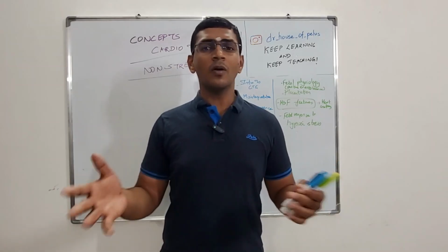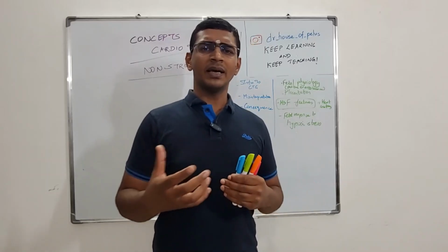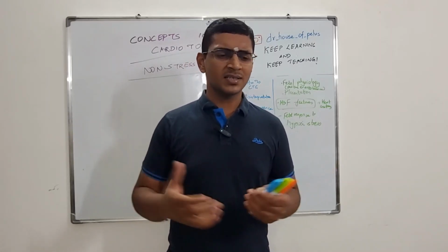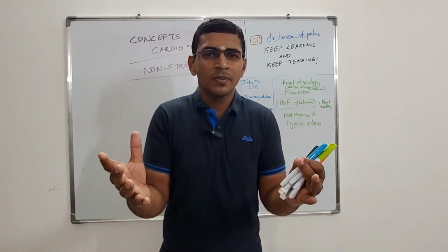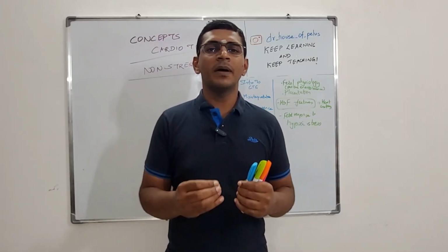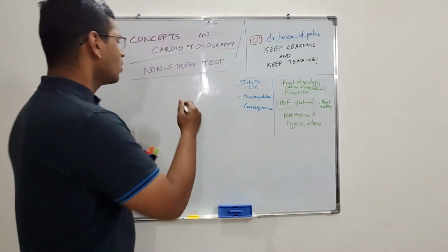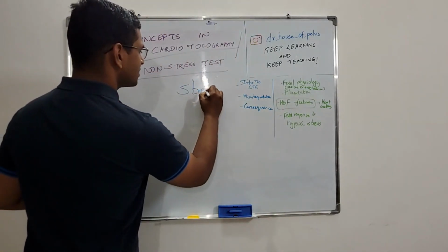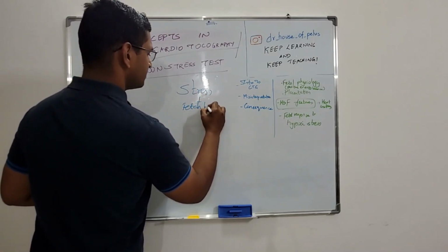So then, around the 1960s, they tried to develop a test called the non-stress test. Why non-stress test? What is the stress? The stress is nothing but fetal hypoxia. So the stress in non-stress test is fetal hypoxia.